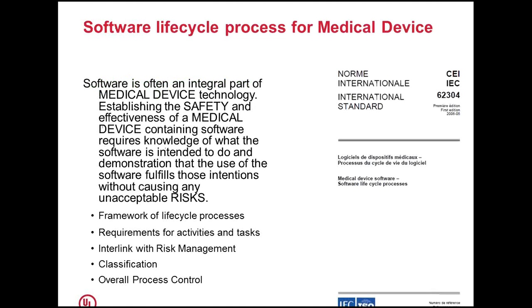Firstly, I would like to discuss why there is a specific requirement for a lifecycle process for medical devices. As I said, medical device software is playing a huge role in controlling the medical device with respect to safety and performance, which is directly going to impact the patient who is getting the care from the care provider. So software is an integral part of medical device technology nowadays.